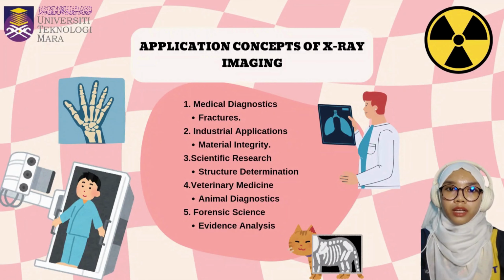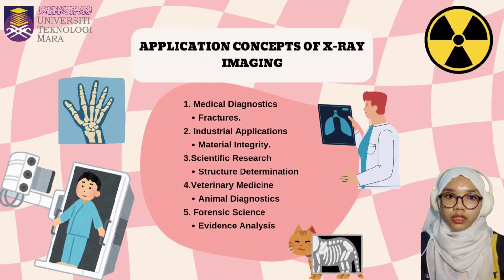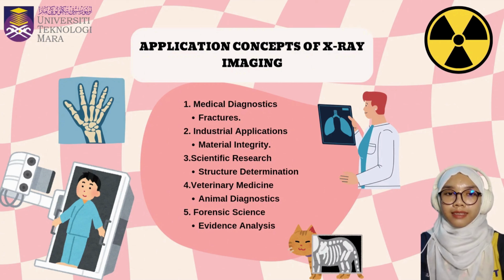X-ray imaging is widely used across various fields due to its ability to provide detailed image of internal structure. Here are primary application concepts of X-ray imaging. First is medical diagnostic, which is fracture, identifying and assessing bone fracture. Second is industrial application, material integrity, inspect weld casting and structural components for internal defect without damaging the material.